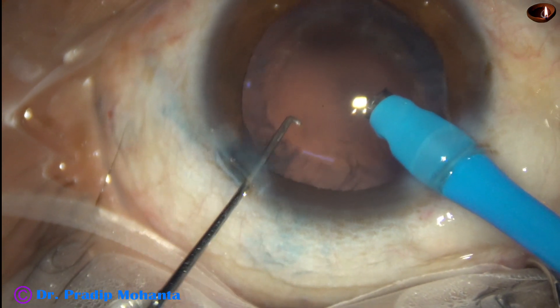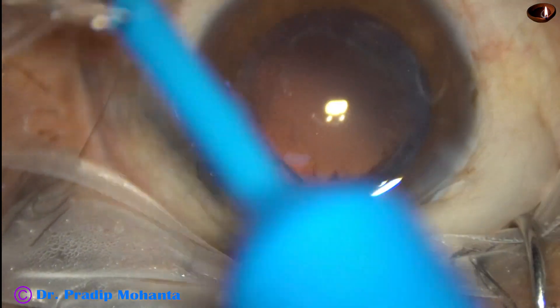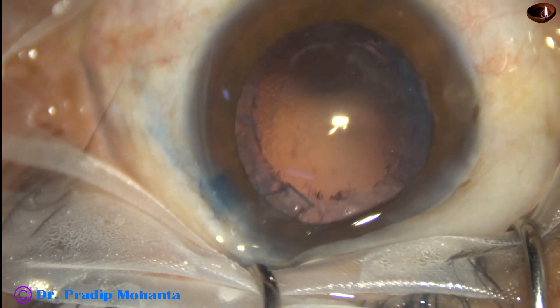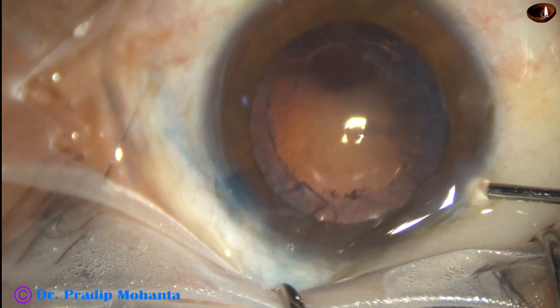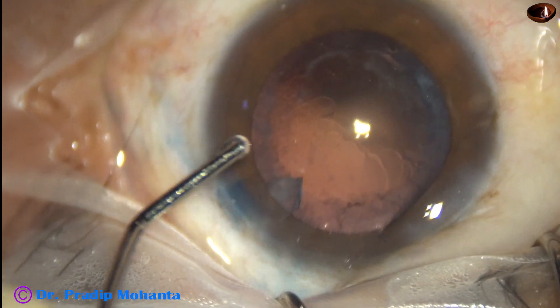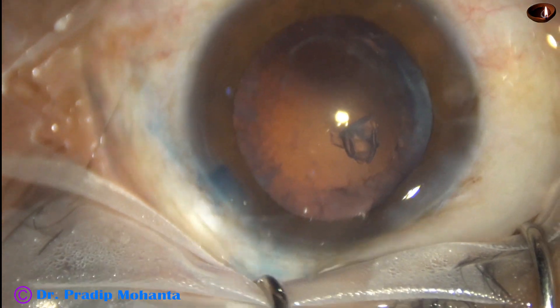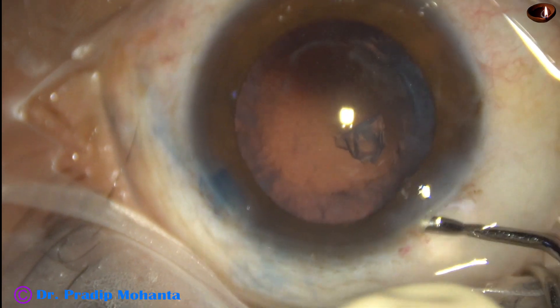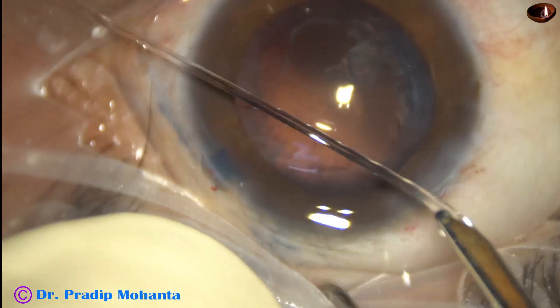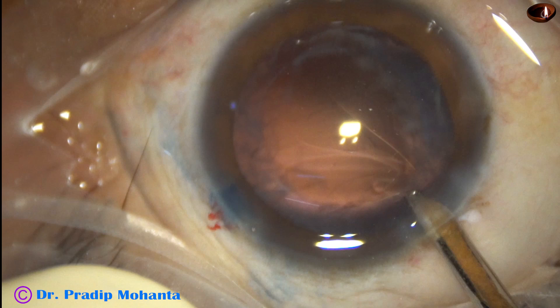This is the last nuclear piece. There is a nuclear piece or epinuclear piece near the side port. Before aspirating the cortex, you must remove this piece. It should not get hidden under the iris, and it should not cause endothelial decompensation postoperatively at the 6 o'clock position.